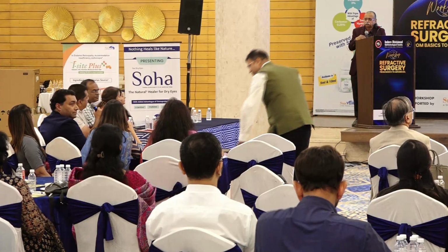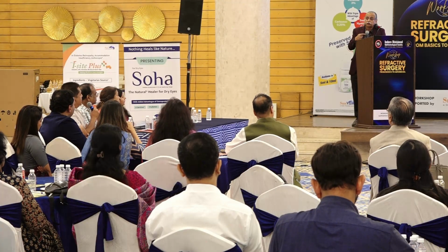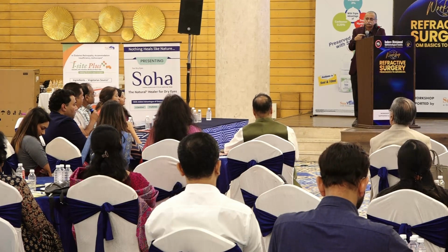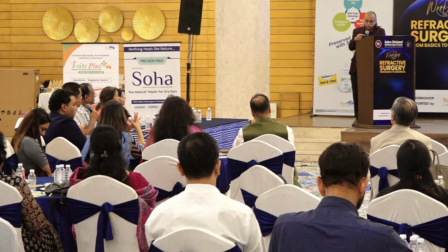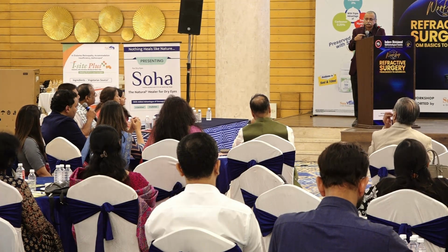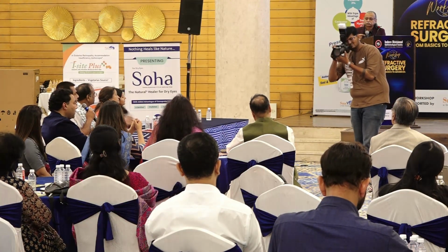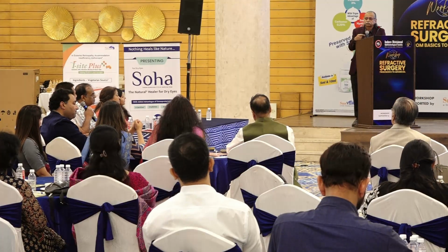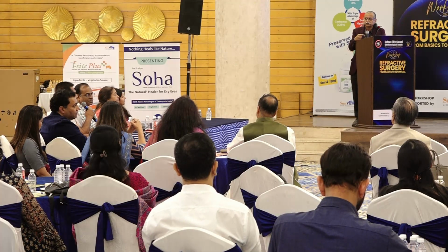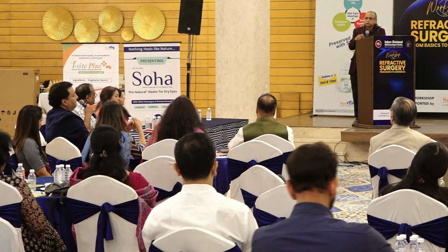Sir, what about lenticular aberrations? Lenticular aberrations have been taken care of. So my question is, when you treat the lenticular aberrations at the corneal level, because we are treating at the corneal level. Yes. So lenticular aberrations we are taking care of over there, and suppose that patient goes into cataract surgery later on, and now we are putting an implant over there. So definitely the aberrations which were corrected will be opposite-side aberrations. Absolutely. And maybe the IOL may have different aberrations. Correct. But what will be the outcome in those patients?